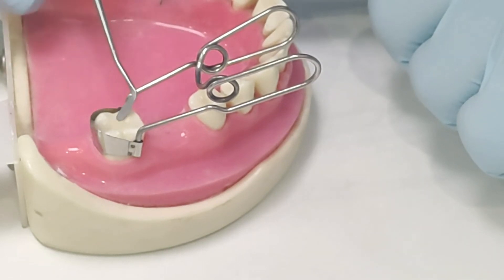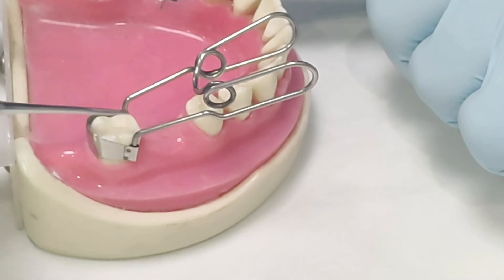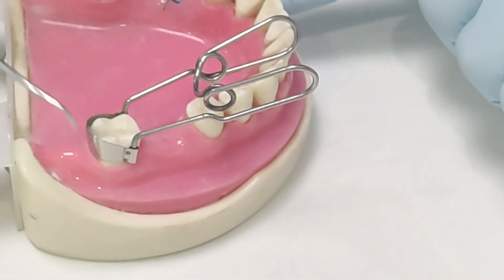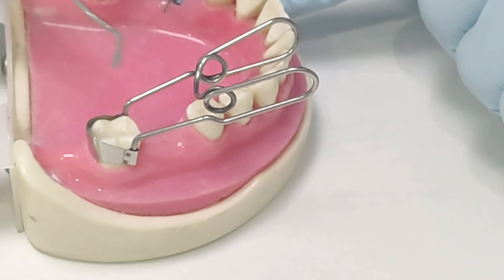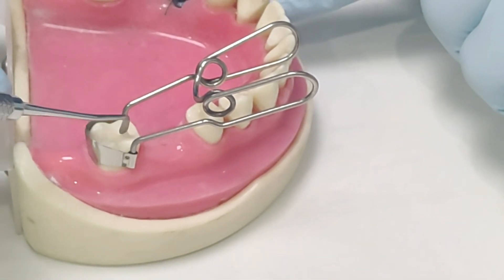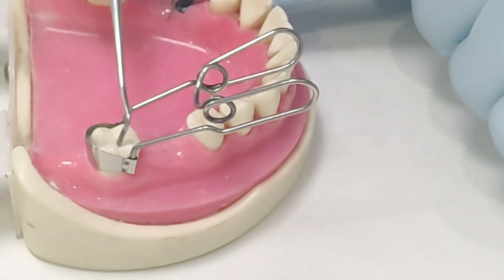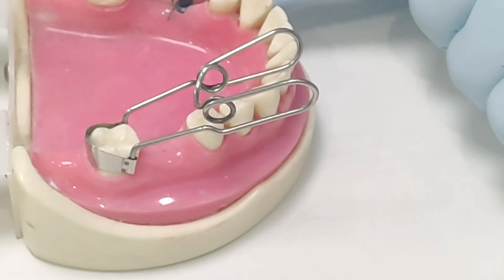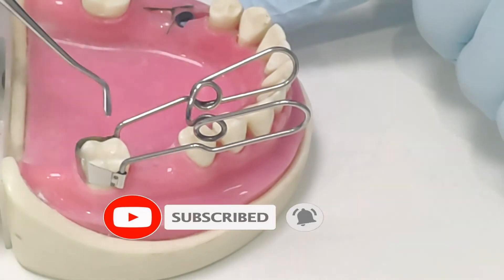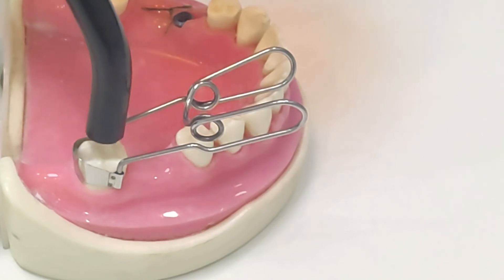This is Solare X that I'm using, and it also has excellent handling properties. It's absolutely not sticking to my instrument — you can see there's no composite on my instrument. Whatever I want, I can just place it there; it's not going to stick to my instrument and give me nightmares. I've used a lot of composites, and good handling is the one thing I always make sure is present. As you can see, we are ready with our cavity in just a matter of five minutes.